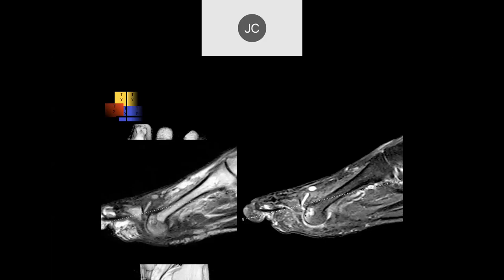The base of the proximal phalanx is dislocated — it should be down in this area. There's going to be marked stretching of the plantar plate as it goes up. You have to be very concerned about rupture and possible retraction of that flexor tendon. This was a complete traumatic disruption of the plantar plate with proximal retraction of the flexor tendon.